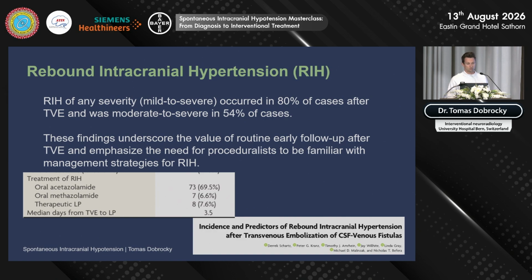After the procedure, this is a phenomenon that we observe quite frequently, especially after transvenous embolization. The patient was in a state of hypotension, and now the fistula, the CSF leak, is being closed. What we see quite regularly is that they enter a state of hypertension.